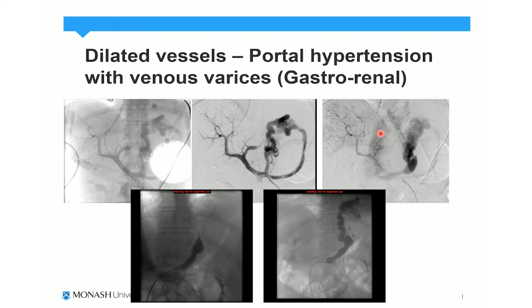This is a patient who's having a procedure to shunt, bypass their liver. It's basically what they call a transjugular intrahepatic portosystemic shunt. So it's basically where a catheter is put into the hepatic vein, and then a needle is passed across the liver into the portal vein, and a stent passed across.